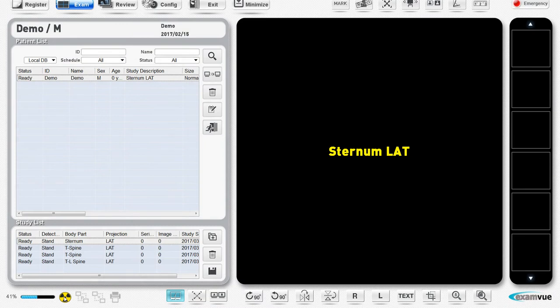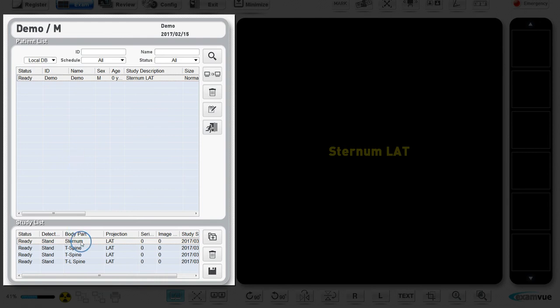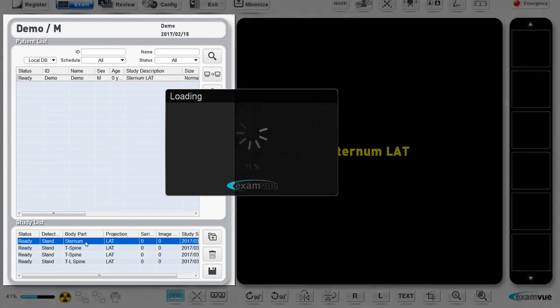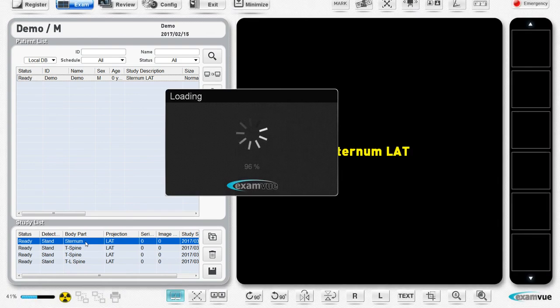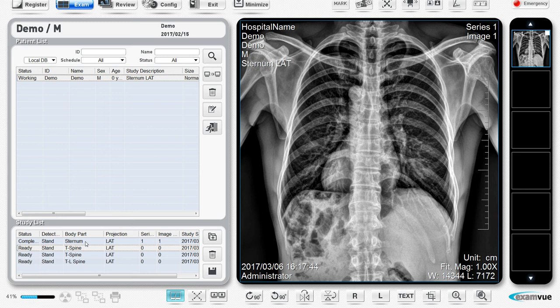The patient list will have all the patients you are registered but have not been finished taking x-rays on. It will automatically select the first view on the study list so you can take the first x-ray. Position the patient and take the exposure. After the image is acquired, the software will automatically move to the next scheduled x-ray. If you follow the scheduled exam, you will not have to touch anything in the software until the exam is complete.